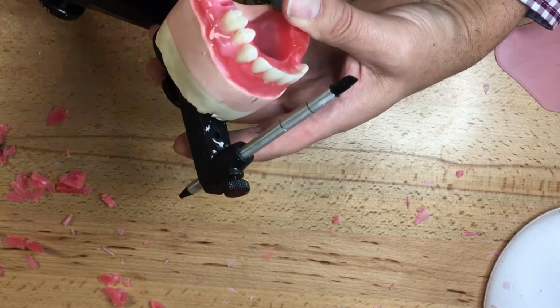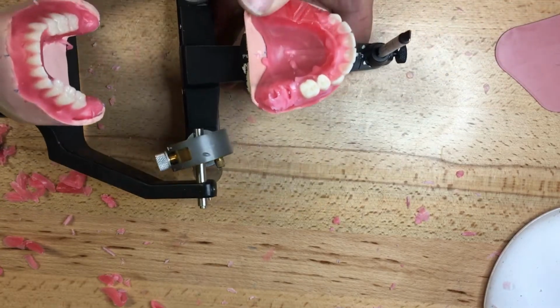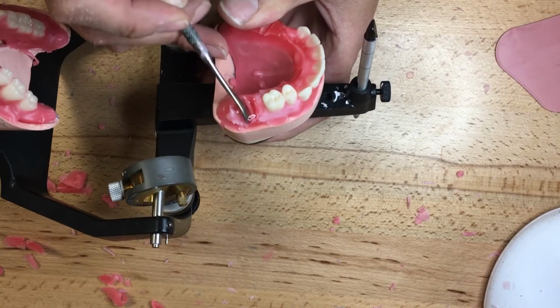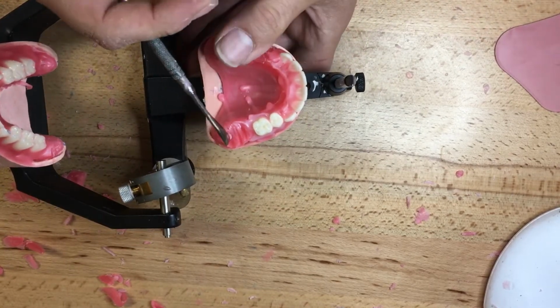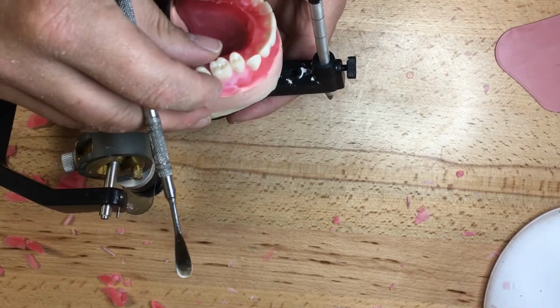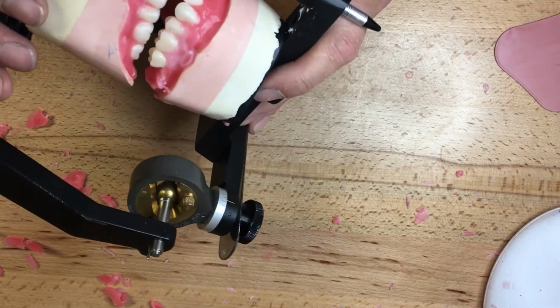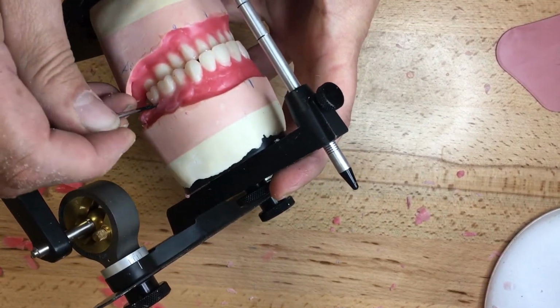I'm pretty happy with where that tooth is. I'm going to add some wax around the collar, the gingival margin. Anticipate the waxing stage. Let's re-soften the wax here. I may run into room if I hit this tuberosity of the base plate here. And this falls into place.